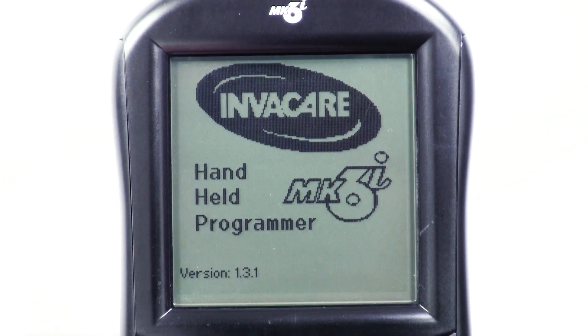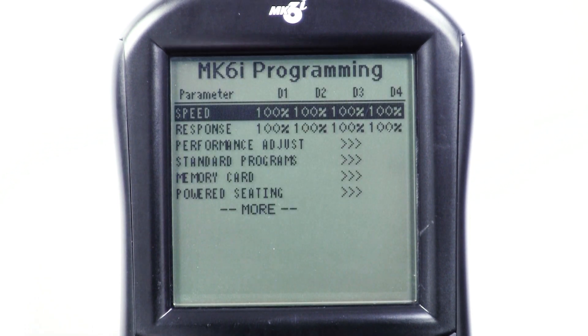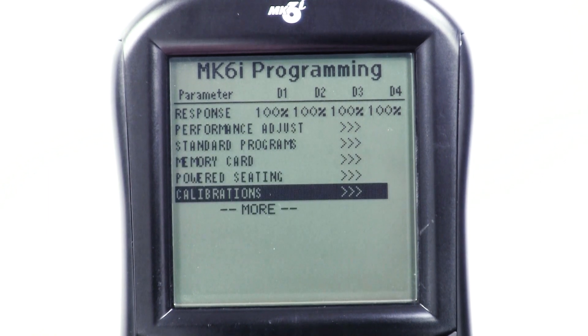To calibrate sip and puff, plug the programmer into the chair. Turn the chair on, then turn the programmer on. Scroll down to the calibrations menu and press select.